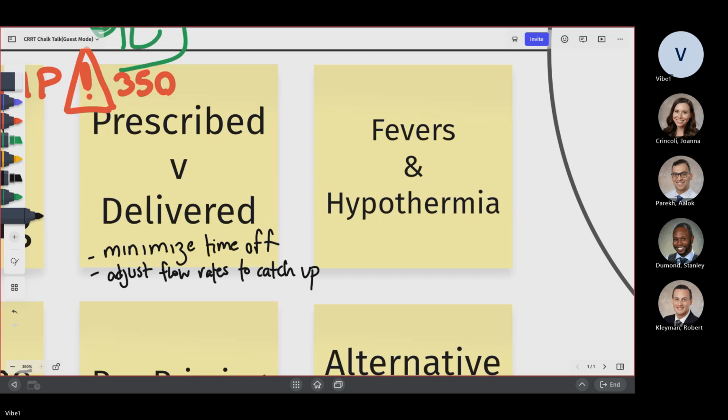Do you have a preference in terms of using a double lumen if you're going femoral, or is a trialysis fine? Doesn't matter. We have tried both. We have used double lumens, we have used trilumens. We haven't found much difference. The only thing sometimes they say is, when you're giving a third agent through the trialysis, because the two ports on the catheter are close by, there's a high chance that the medicine may just get recirculated. That is the only thing they sometimes say about it. But other than that, it doesn't matter technically.